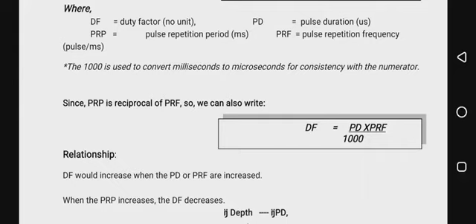Since PRP is reciprocal to PRF, we can also write duty factor as pulse duration times PRF over 1,000.